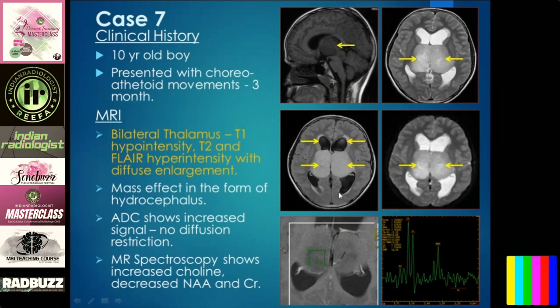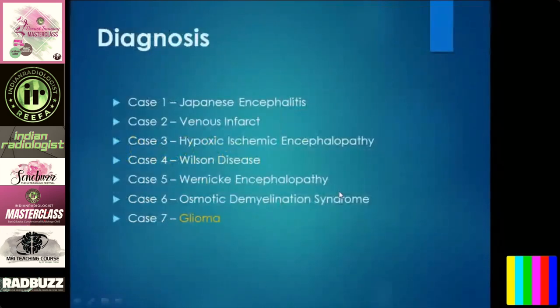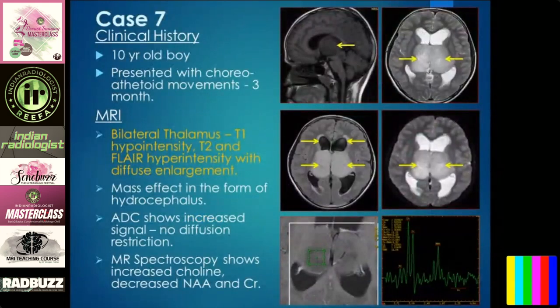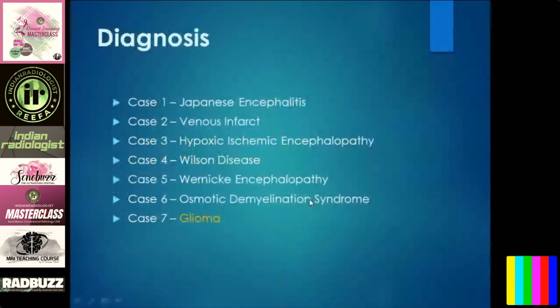MR spectroscopy showed increased choline peaks and decreased NAA. This was a classical case of glioma. You should have very good knowledge about glioma imaging and spectroscopic findings. In an exam, they also ask about the line of treatment — whether it is medical management or surgical management — for all the above conditions discussed.